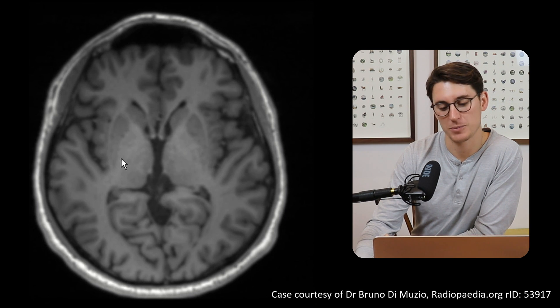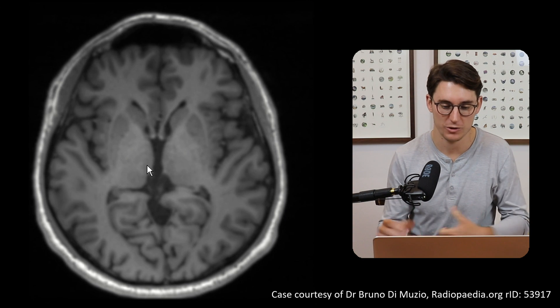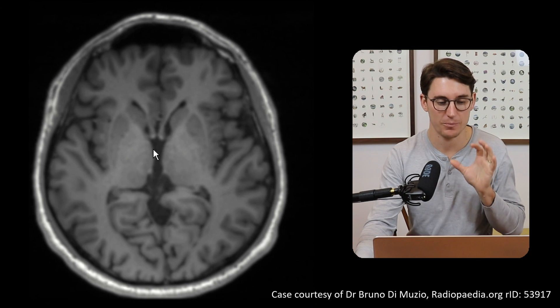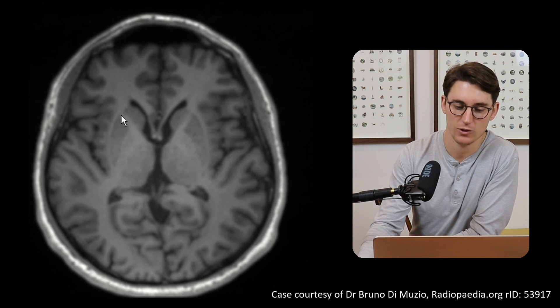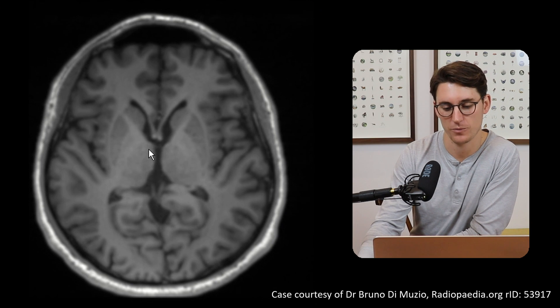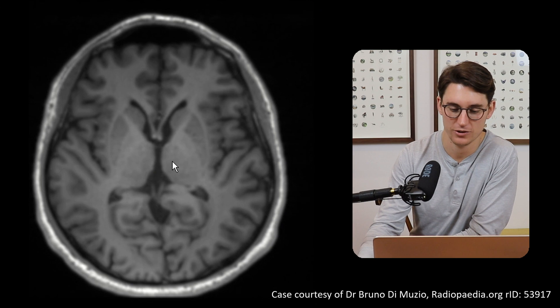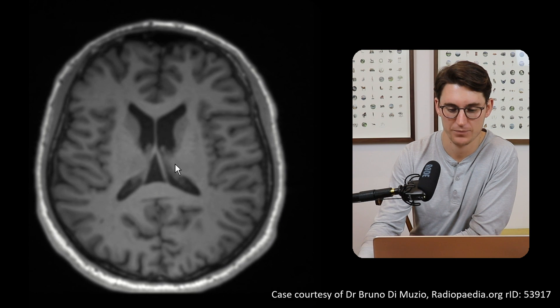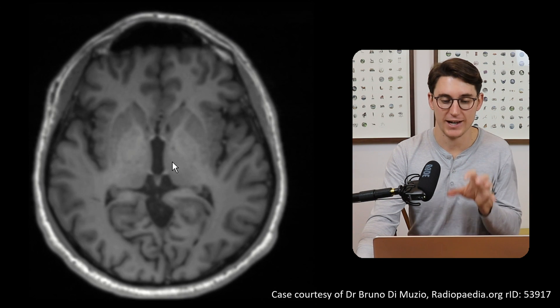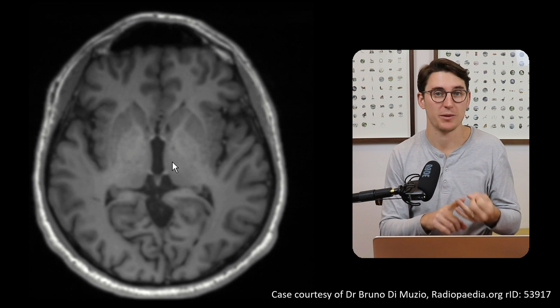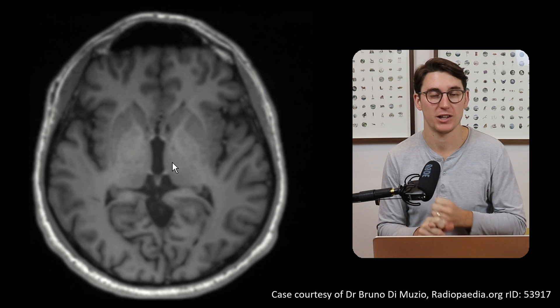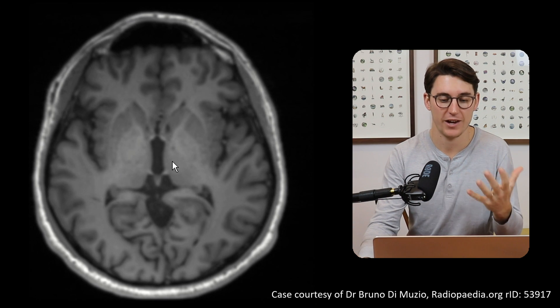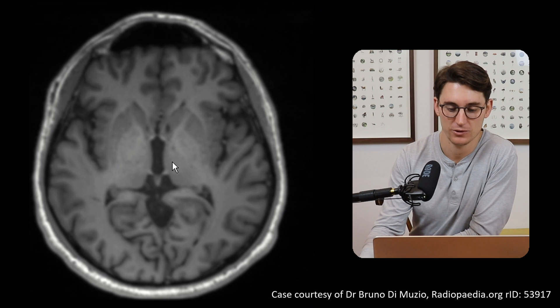The globus pallidus is separated into the globus pallidus externa and the globus pallidus interna, which we'll see better on coronal views. It is separated from the caudate by the anterior limb of the internal capsule, and from the thalamus by the posterior limb. So we've covered the caudate, the putamen, and the globus pallidus. The next two nuclei are the subthalamic nuclei and the substantia nigra — those five areas make up our basal nuclei.